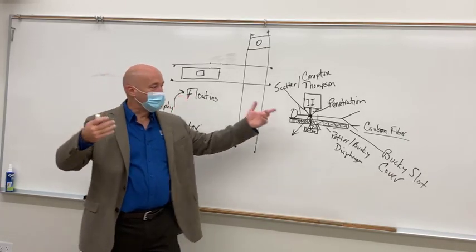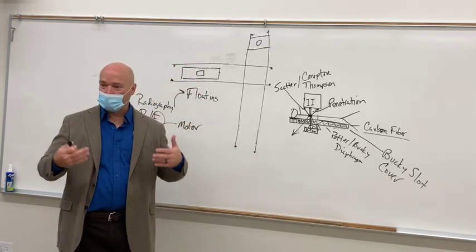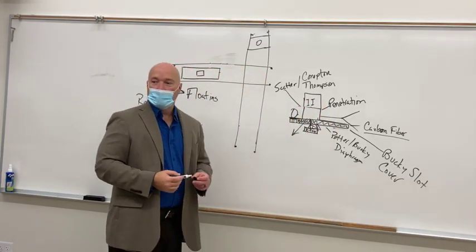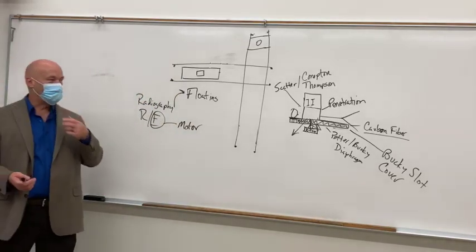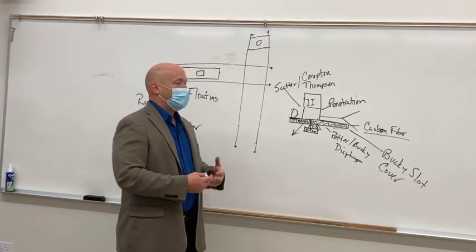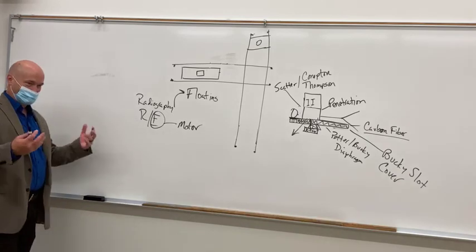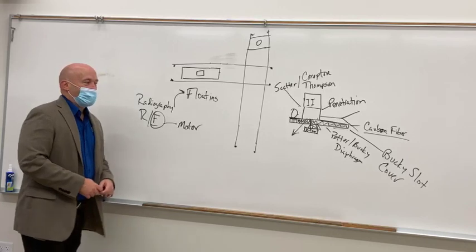Have you ever seen anybody use the fluoro unit without that drape? You should have a drape over the front of it that goes from the image intensifier, so that you can't even see the patient really. I've never seen that. You've never seen them use it? Yeah. Oh, that's brilliant. Yeah, they should be using that. It's basically like a double layer lead apron that just hangs from the fluoro tower itself. So that's a big thing of shielding right there that they should be using.